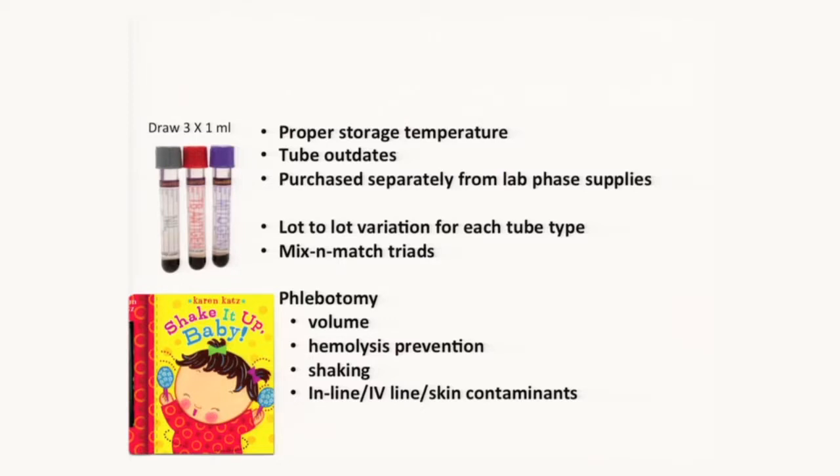So that's extremely important. And things that are a little more theoretical, or if you're drawing from a line in the hospital and there's heparin or there's something in there, if there's a bunch of Staph aureus on the skin and you try to clean it, but you go through and there's a superantigen or something stimulatory in there, that could be bad too. So I think you'll see this when we look at the statistics for the indeterminates.